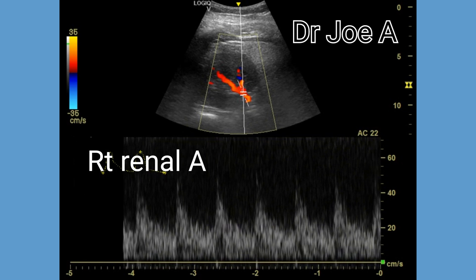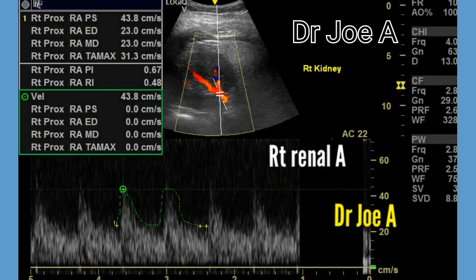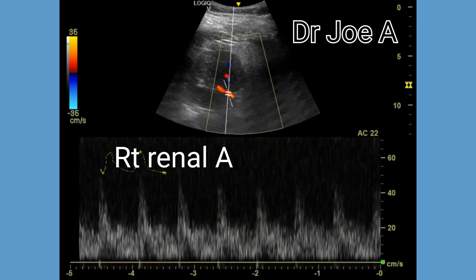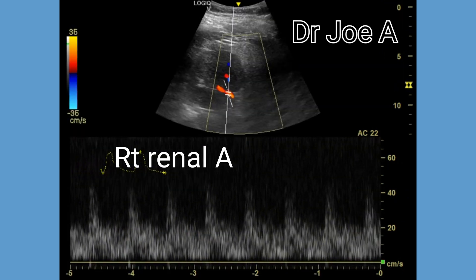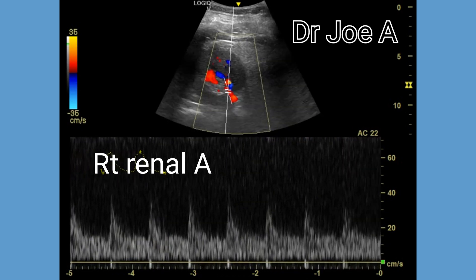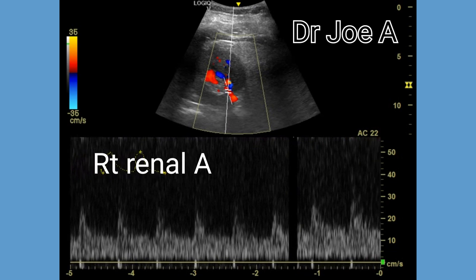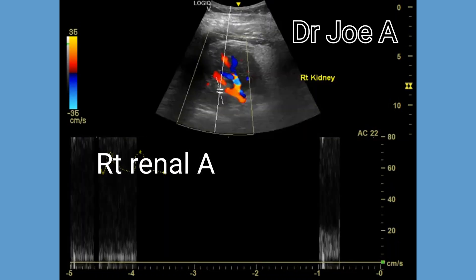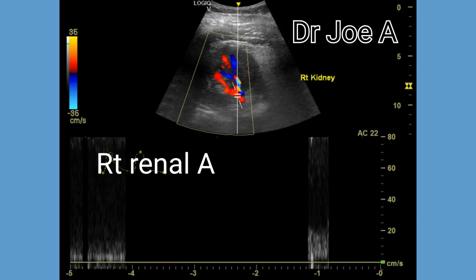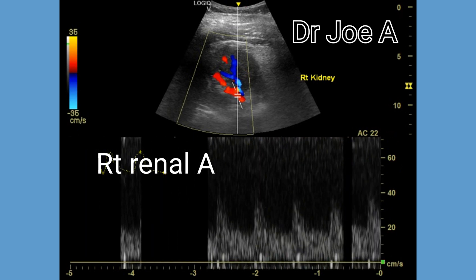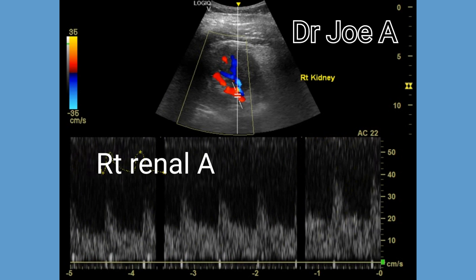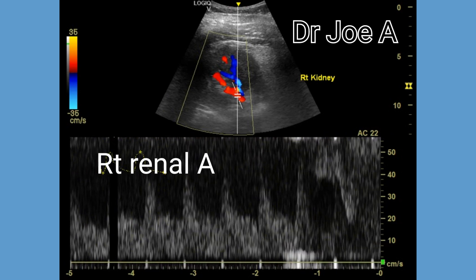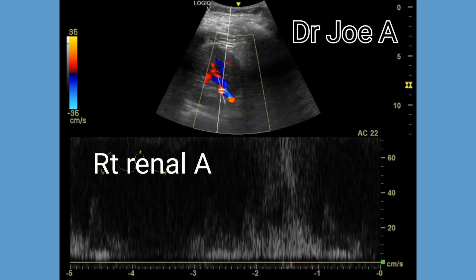Next we go to a spectral Doppler of the renal arteries. The normal spectral Doppler waveform of the renal artery has a systolic peak followed by almost continuous diastolic flow. The diastolic flow is due to the elastic recoil of the vessel wall, while the systolic flow is due to cardiac contraction. The peak systolic velocity in the renal artery is typically less than 180 centimeters per second.